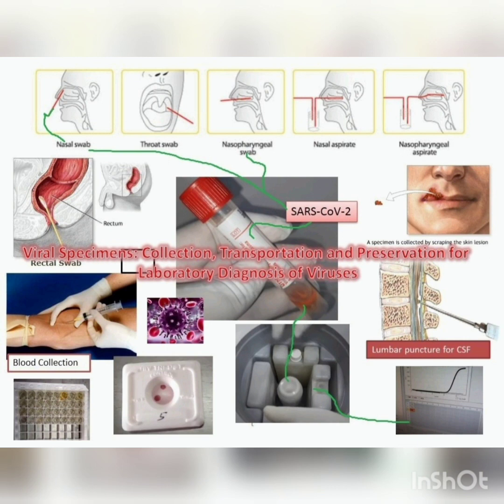You need to collect the specimen and send it to the laboratory. The laboratory may be in your hospital, or it may be located somewhere away from your hospital. For example, the coronavirus laboratory is at BIMS, Belgaum. From Gokak, Chikkodi, Ramdurg, Munnoli, all the taluka hospitals send the specimens for RT-PCR, the RT-PCR for coronavirus.